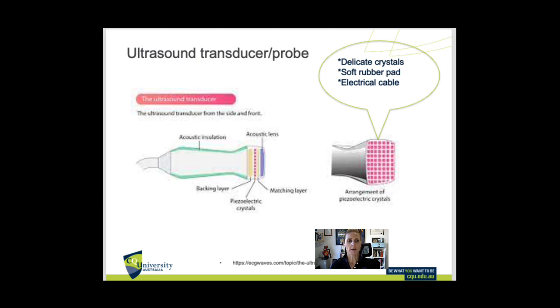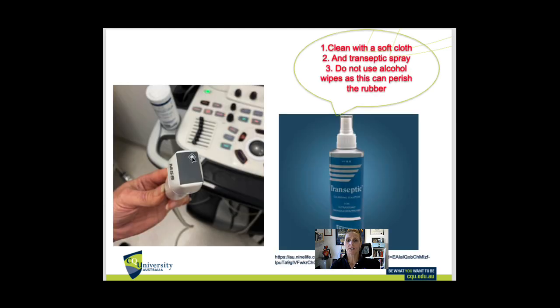There is also a rubber pad on the end of the transducer which can erode and corrode if too much alcohol is used. So there are certain non-alcoholic wipes we can use. Vendors advise using a soft cloth when cleaning gel off, and for disinfectant either non-alcoholic disinfectant wipes or a specific ultrasound spray for the transducers.